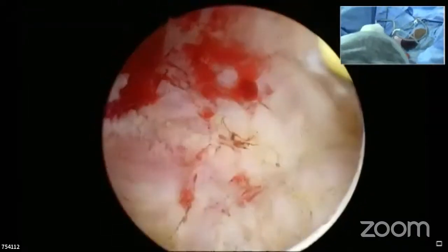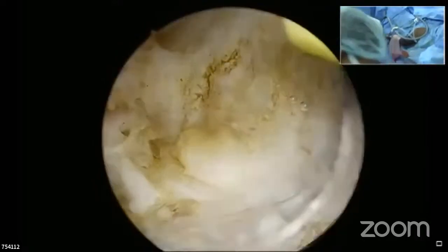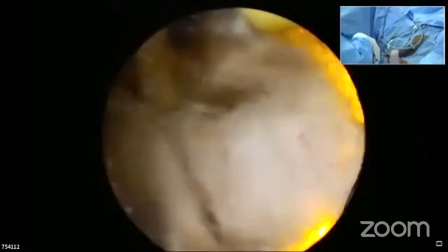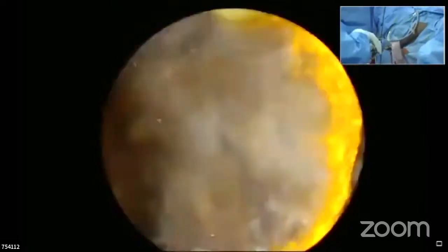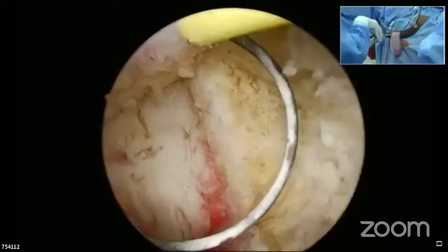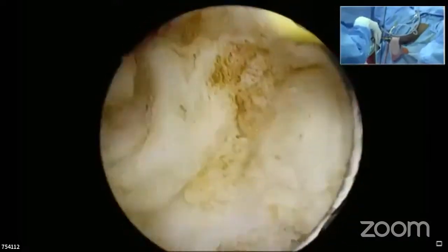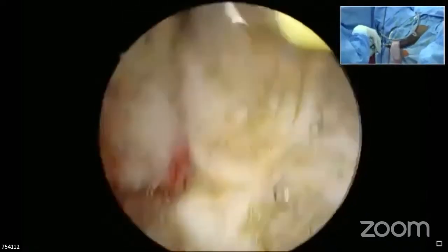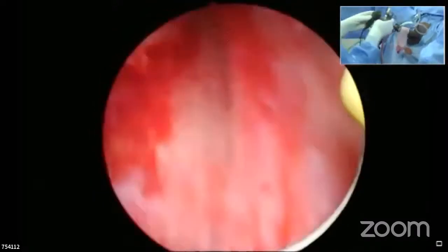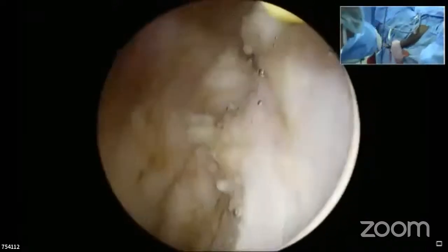Dr. Gupta, can you add something over there? No, what he said is right. We have already discussed this point that we have to preserve the mucosa, resect only the adenoma by scooping in that area, and small cuts have to be made. There's no doubt about that. And I come up to the mid of the verumontanum. In this particular case, I think some tissue still needs resection from the apical area. Come out and see where the verumontanum is, and you will appreciate that. See that, so this tissue has to come out.